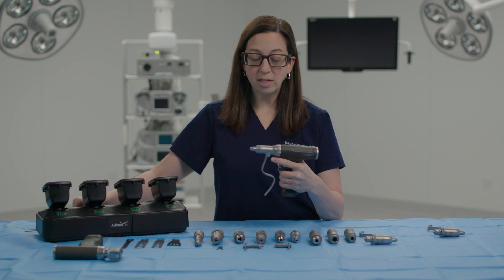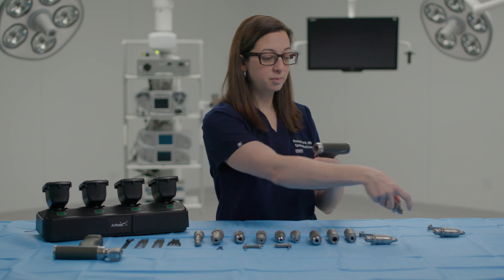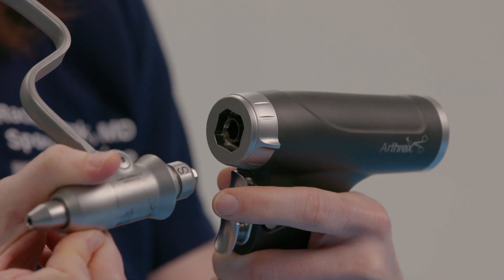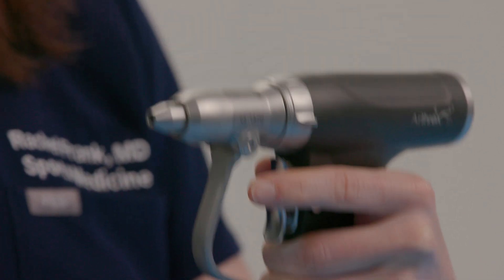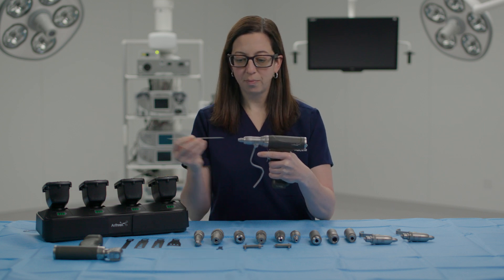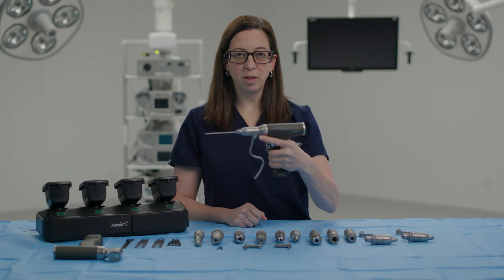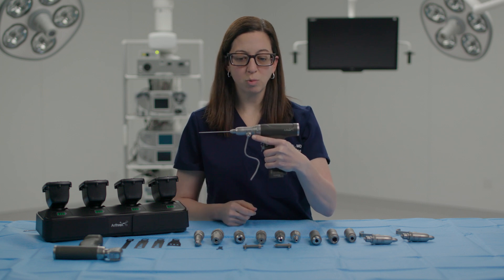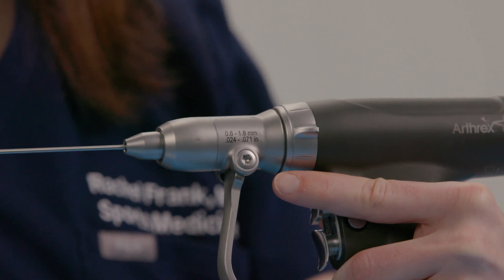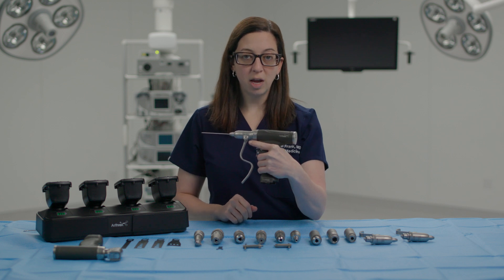We'll take the pin out when we're done and say we want to now put in a smaller pin. Simply use the twist mechanism. Now we're going to use the smaller attachment, and we can see it's clearly labeled with an S. Easy to pop in — we'll take a smaller wire. As long as it's within the size that this particular attachment allows, which is very clearly labeled, you no longer have to worry about where your pins or K-wires are going. This makes it so much easier for both you and whoever's handing you the instruments.